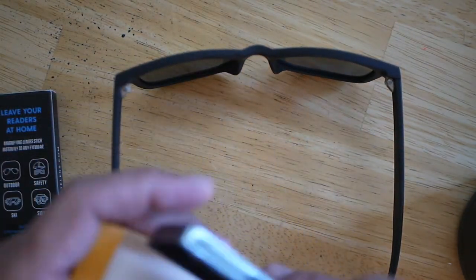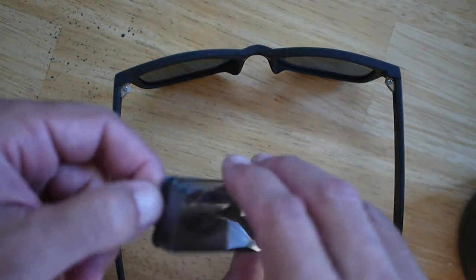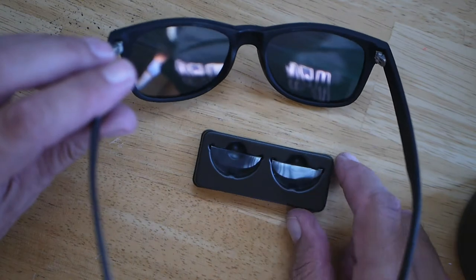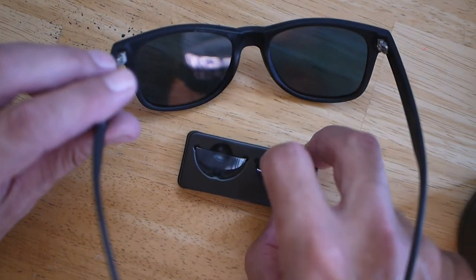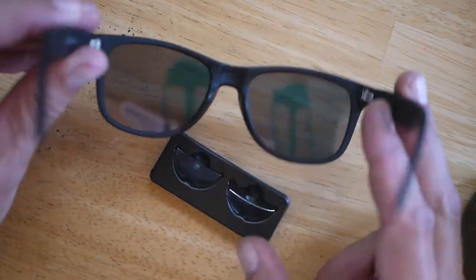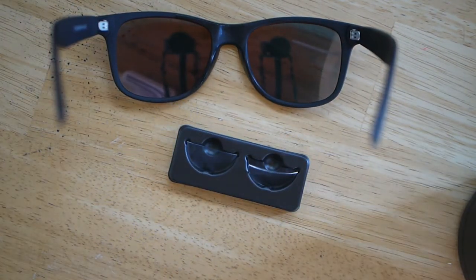Let me go ahead and get these removed from the packaging. We're going to get our water set up and give this a shot. I've seen where you can cut these down with scissors. They're pretty thin plastic, so we could cut them down in any shape we want. But since this is the first time we've done this, we're just going to try it out and see how it goes.